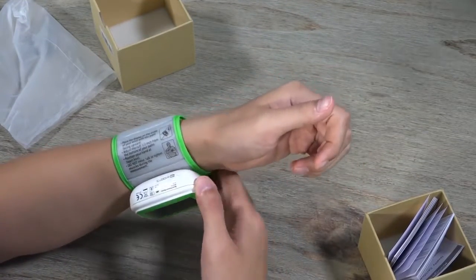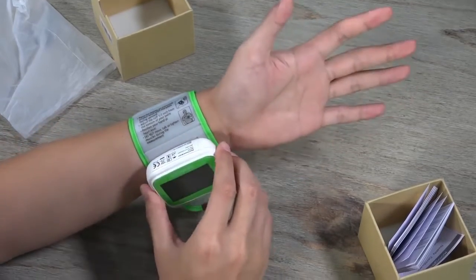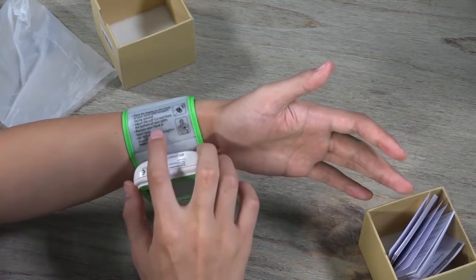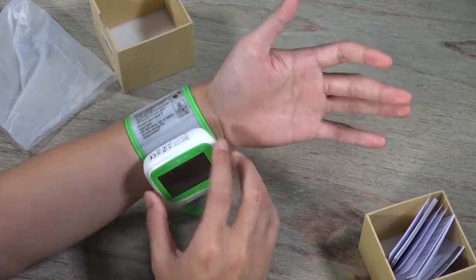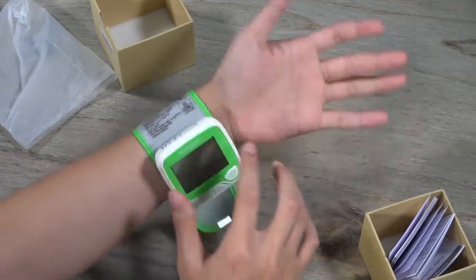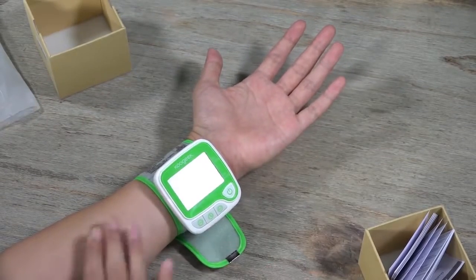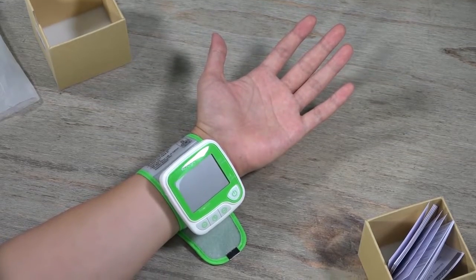Second, adjust the position of this device on your hand and position your hand at heart level. This is important because if you want to get an accurate result, you have to follow this instruction. As I am sitting and placing my hand on the table, my hand is actually at my heart level — parallel to the height of my heart.